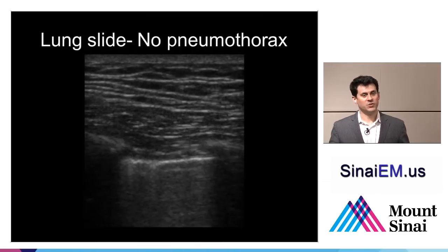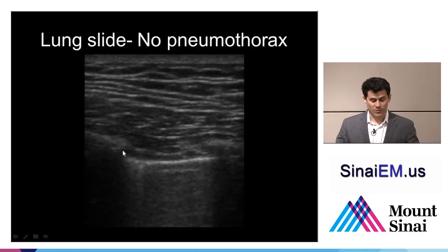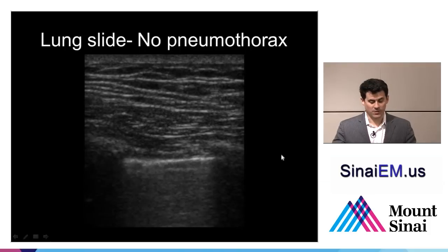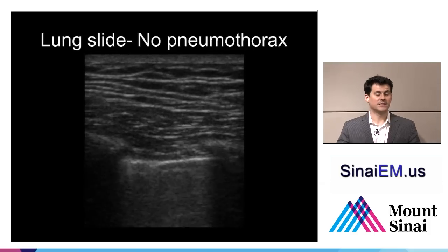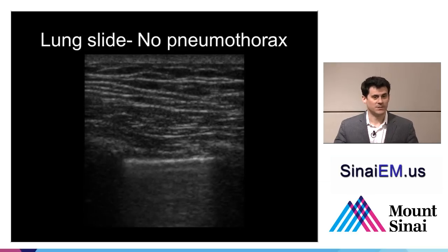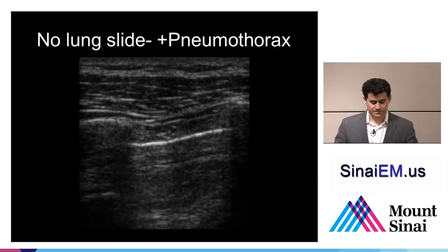And when the lung is visualized over a few respiratory cycles, you'll see that it slides from side to side. So we can see here skin, sub-Q tissue, the ribs here and rib there, and this bright white line. And what we see is motion to and fro. So moving towards the right, moving towards the left, moving towards the right again, and back to the left. That is lung sliding. It might seem a little subtle at first, but if you let your eye get adjusted to it, it's not too bad. And certainly, in my opinion at least, less subtle than looking for the lung edge on a chest x-ray.